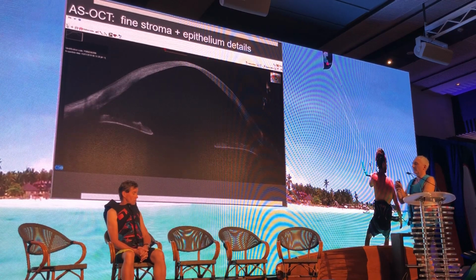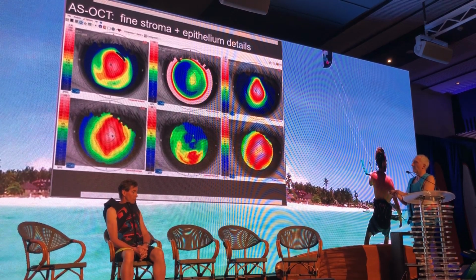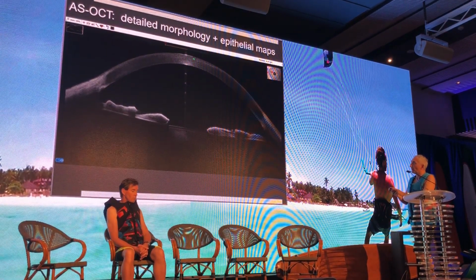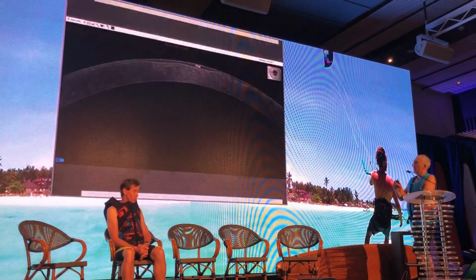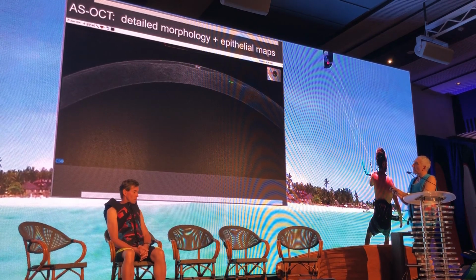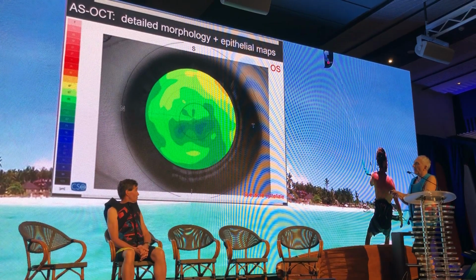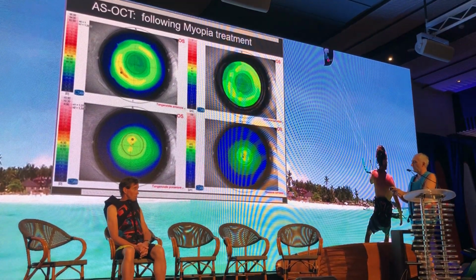More advanced keratoconus. I'm sorry, I'm losing time. And where, of course, you see that the epithelial map is more altered than before. And you see very well, here is something wrong going on. You wouldn't see that on the map, but on the anterior map, at a higher definition, you see very well how thick here were erosions many years ago before the patient had keratitis. And you see how they are very well found in the epithelial map. So this is very important to take into account if we think of treating this case with laser.